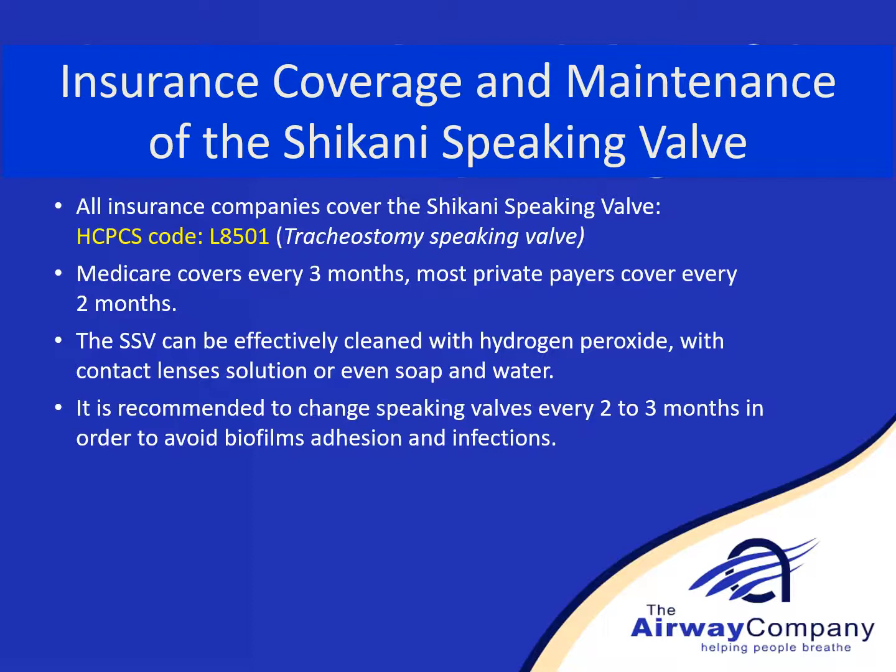The Shikani speaking valve can be effectively cleaned with hydrogen peroxide, contact lens solution, or even soap and water. It is recommended to clean it every day. It is also recommended to change the valve to a new valve every 2 to 3 months to avoid biofilm, which can cause infection. This is recommended for all speaking valves.